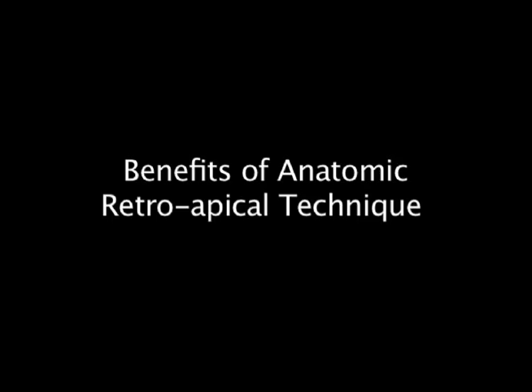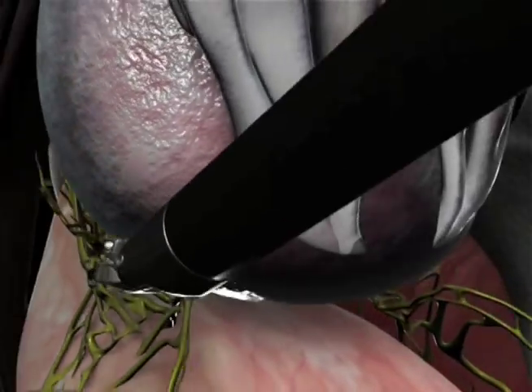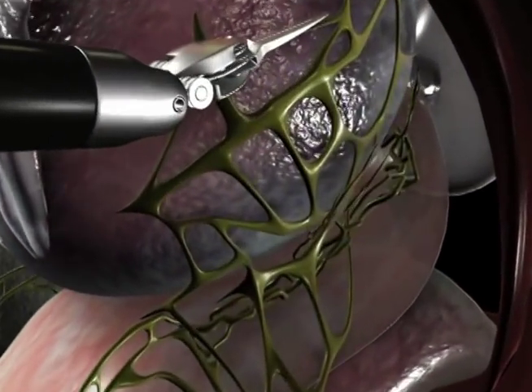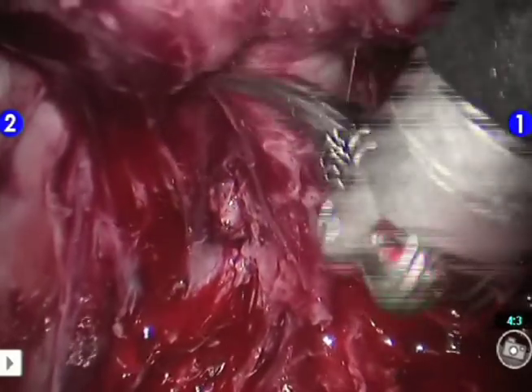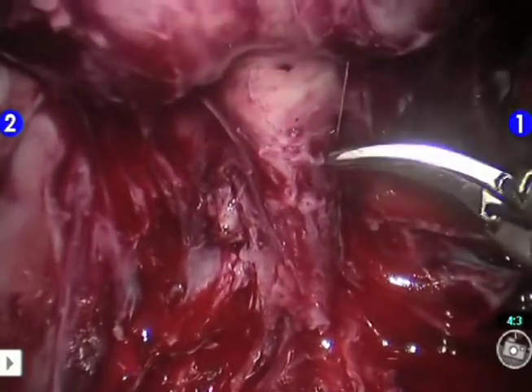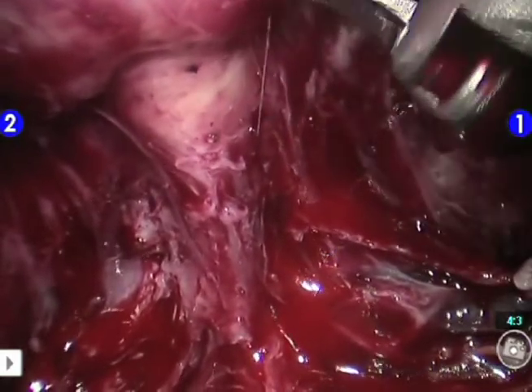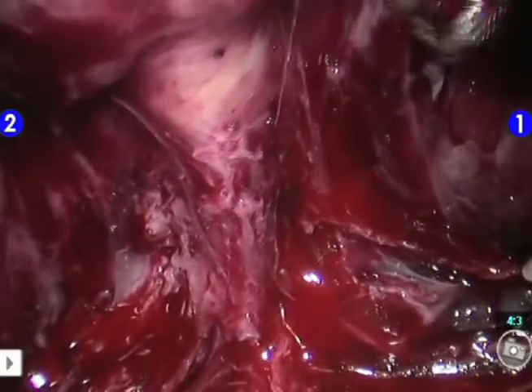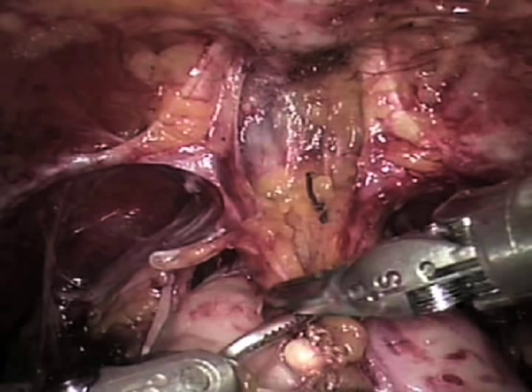Potential benefits of the anatomic retroapical technique: Neurovascular bundles are released out of harm's way before apical dissection, resulting in better sexual function outcomes. The identification of the prostate-urethral junction becomes very easy and precise. This approach allows us to gently push the posterior apical beak away from the sphincter, thus gaining a few extra millimeters of length. Therefore, we are able to preserve maximal length of the urethra. Several other key structures critical to urinary continence are also preserved, including the pubo-prostatic ligaments and arcus tendinius, resulting in better continence outcomes.